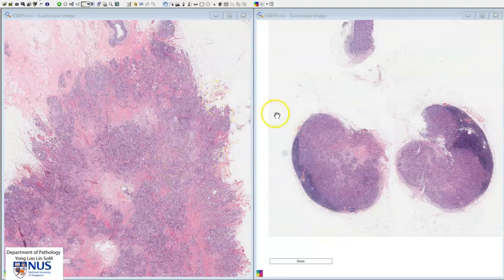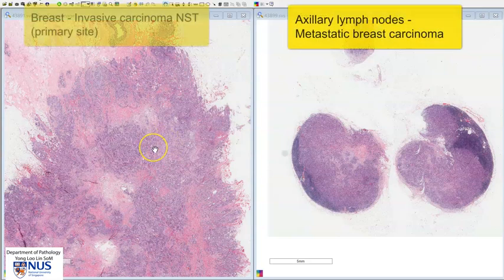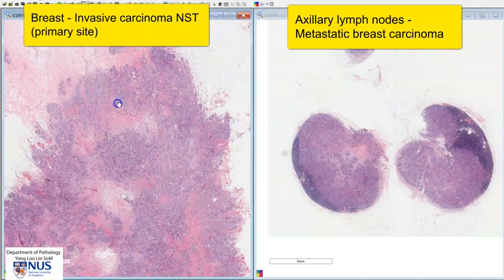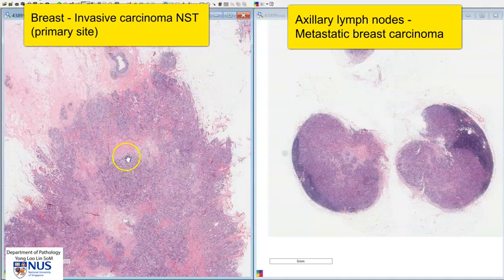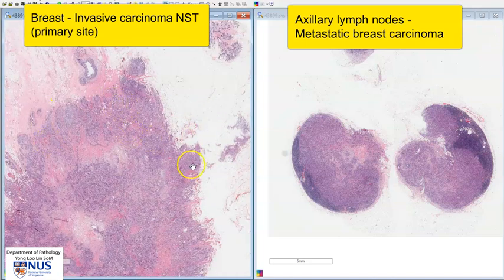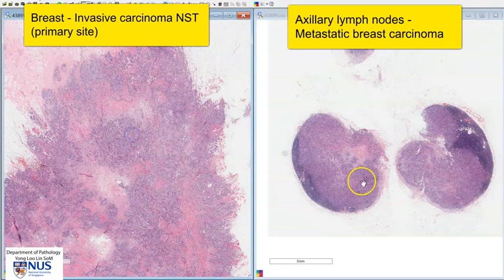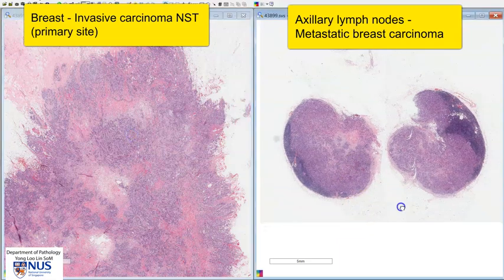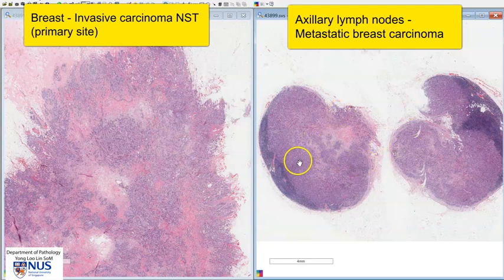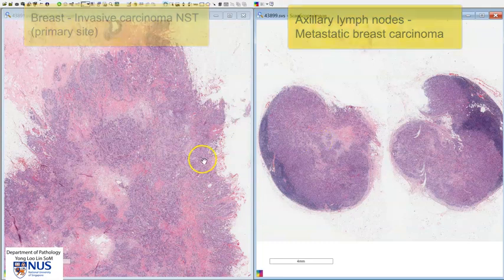Here we are looking at two virtual microscopy slides from the same case of invasive breast carcinoma. On the left, we can see the primary tumor in the breast. We can see here that there is some benign breast parenchyma, and this is the invasive tumor. On the right, we can see axillary lymph nodes — there are two axillary lymph nodes here that are involved by metastatic breast carcinoma.